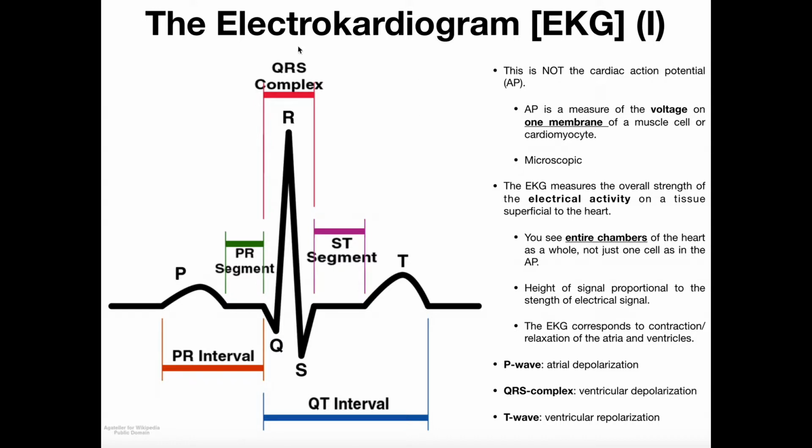Before I do that, though, I do want to mention that notice here in electrocardiogram, I spelled this with a K. It's just to expose you to this. The guy who invented the electrocardiogram actually won the Nobel Prize for it, but he was Dutch. And I believe that in Dutch and also in German, which was the people who I guess kind of broadcast this, so to speak, cardio is actually spelled with a K. And so it typically has the abbreviation EKG because of the K in cardiogram.